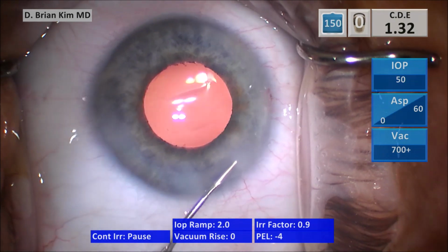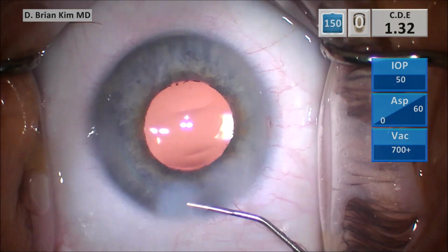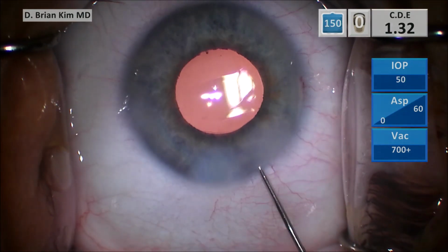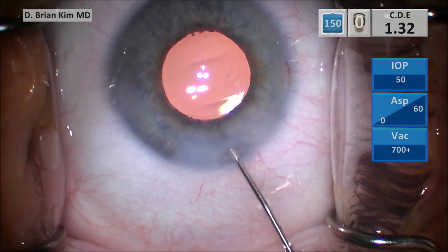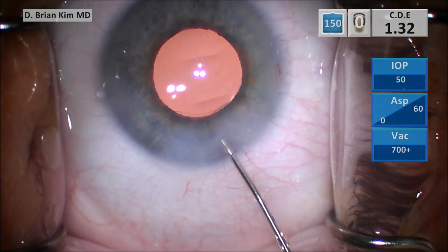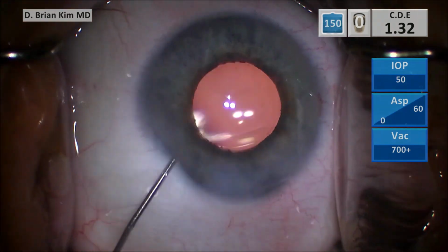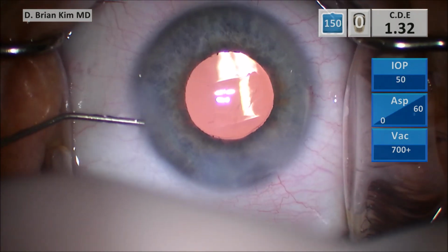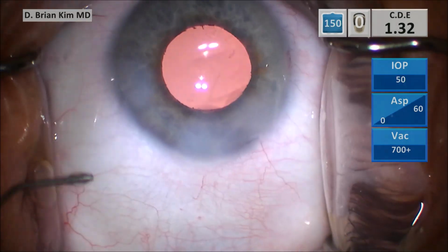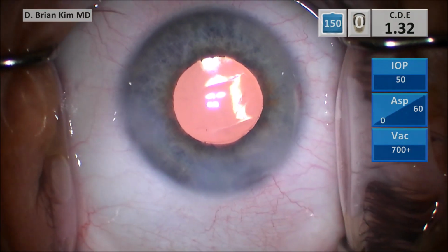So you can see this is using double chop, cross chop, mechanical fracturing, disassembling a fairly moderate sized lens, but more importantly, a very sticky lens. These lenses, even though you break them apart, they still like to stay together. And so when you get frustrated, you might try to use high ultrasonic energy, and it's really not necessary. You can just use mechanical fracturing forces, using the chopper, teasing the pieces apart.